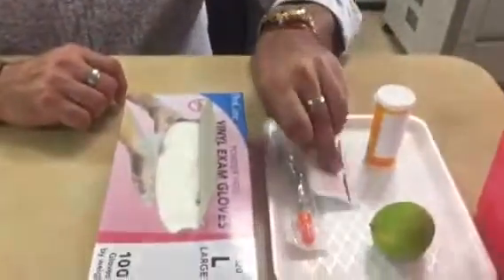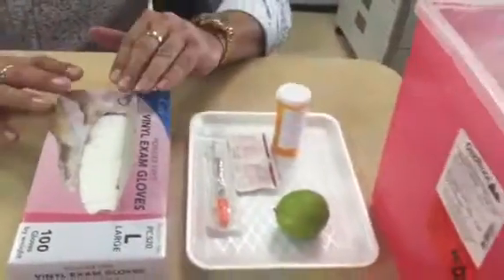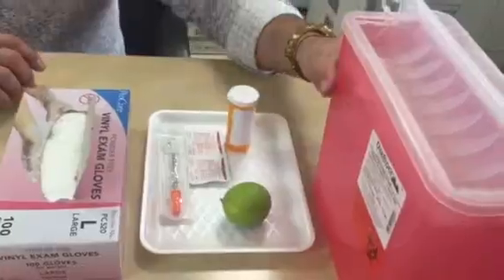The first step is to decide where to give the injection and know how to give the injection. It's very important to note that insulin should be given at room temperature. Gather additional supplies such as syringes, alcohol wipes, the medication, gloves, and a hard container for disposal. It's very important to wash hands with soap and water and dry them well.